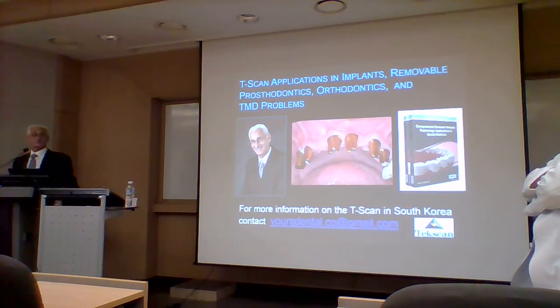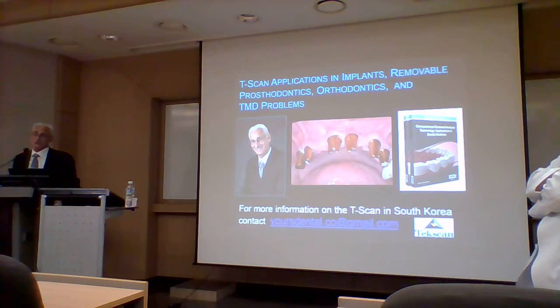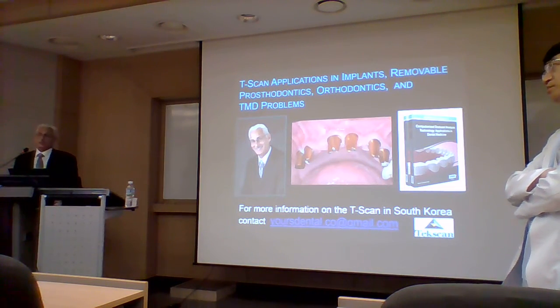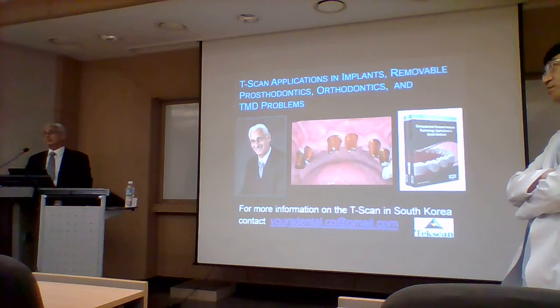What do you think about the zirconia? Well, I go myself towards the softer side. So I do a lot of composite to metal and things like Ceramage, really very easy to repair, very kind to the infrastructures, the abutments, things underneath. Other people would say go with something very hard that they can't break. So again, we don't have the answer.